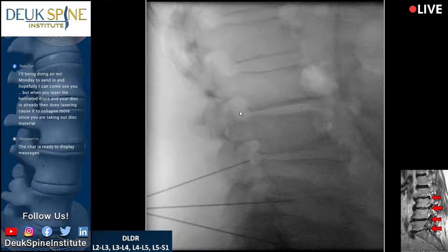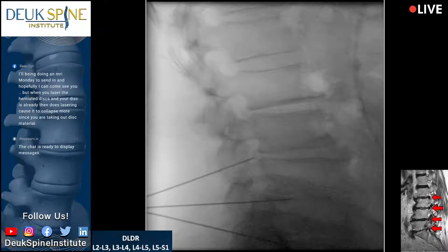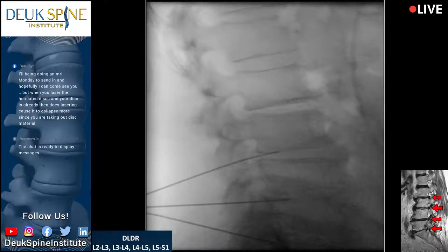There you go. So we usually say you can't see herniations on x-ray because it's true, but when you have a calcified herniation, you can. And that's what this patient has, calcified herniations, which we're going to fix with the laser. We're almost there. These are sensitive areas. This is where all this pain's been coming from. So we're going to fix that today. I'm really excited for him.